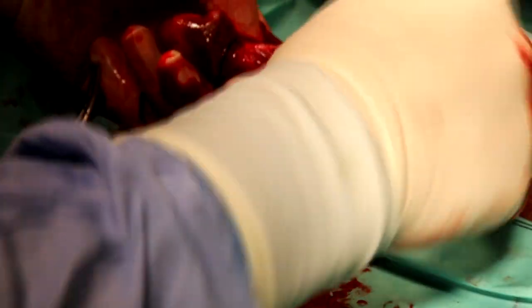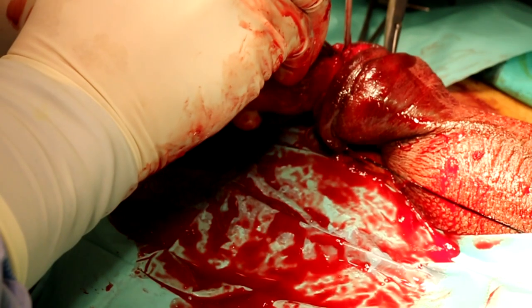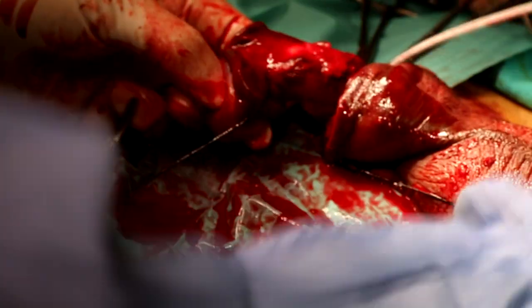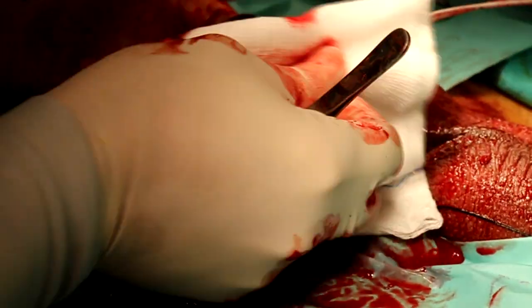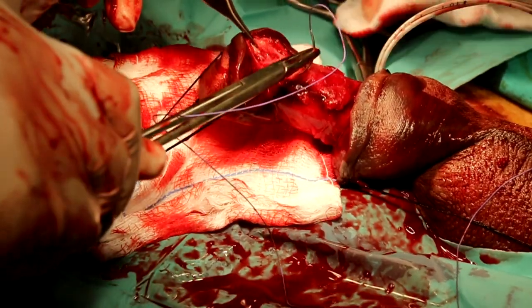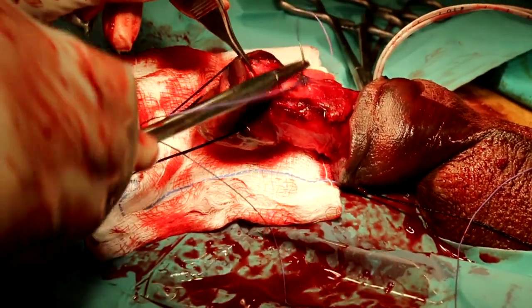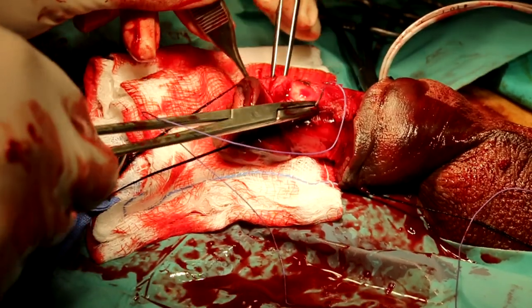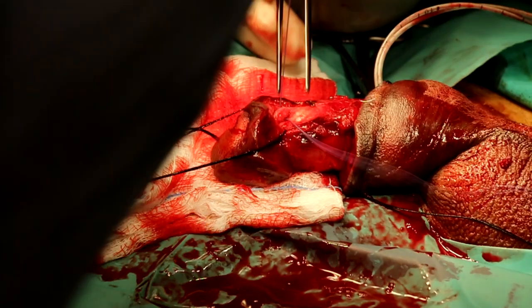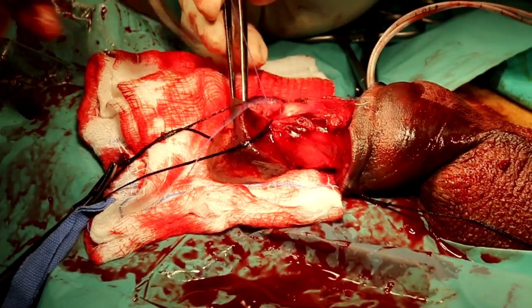I started the previous one to show you, it is so bloody. So you have to use the tourniquet. It's better to use a tourniquet. As you see now, the blood is filling the field. I didn't cut the previous step, just to show you the difference in bleeding. Now this field is clean and bloodless, and I can take my sutures more comfortably.